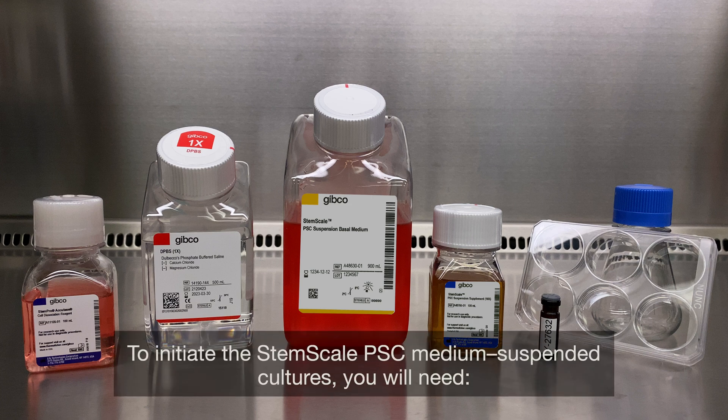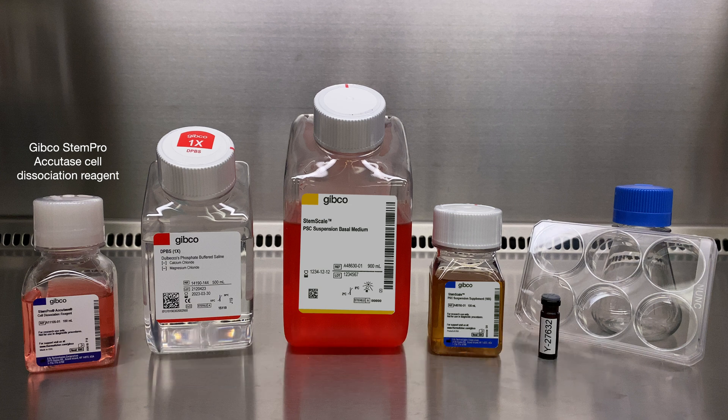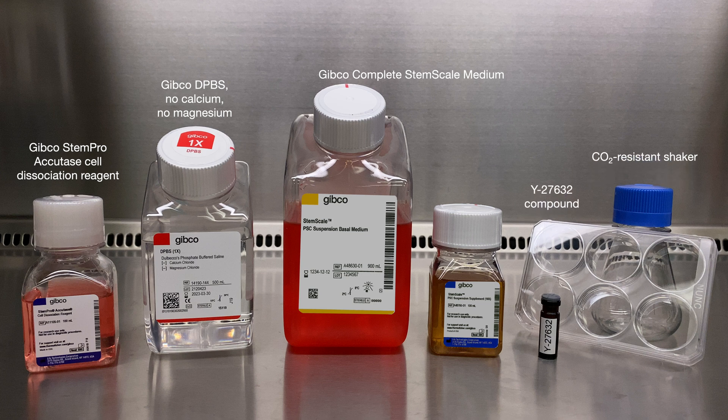To initiate the StemScale PSC Medium suspension cultures, you will need: Gibco StemPro Accutase Cell Dissociation Reagent, Gibco DPBS No Calcium No Magnesium, Gibco Complete StemScale Medium, Y27632 compound, and a CO2-resistant shaker.